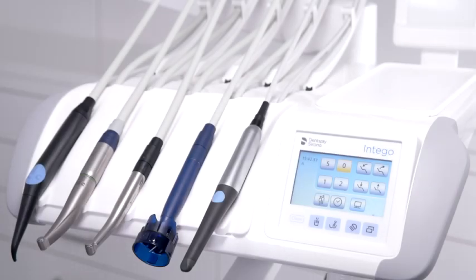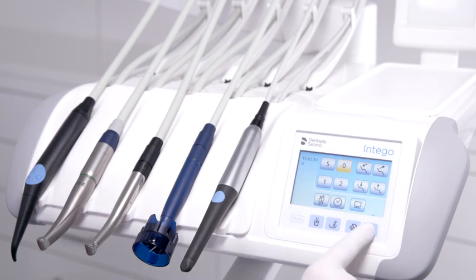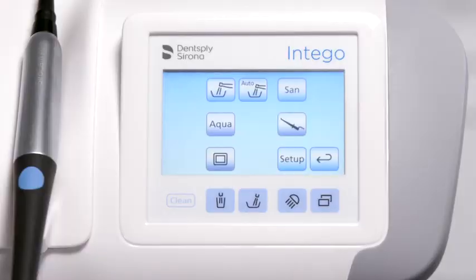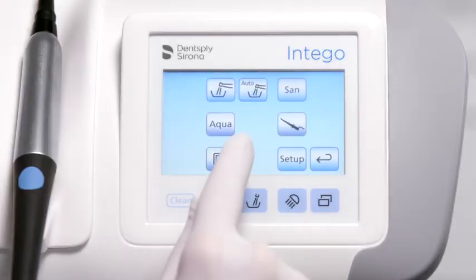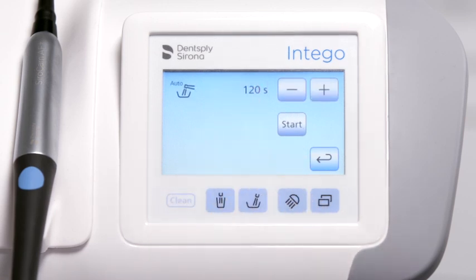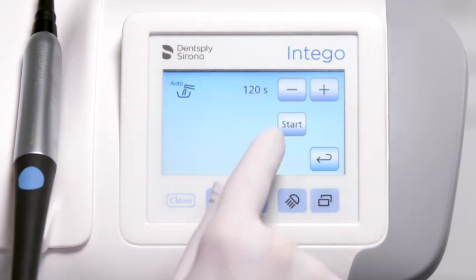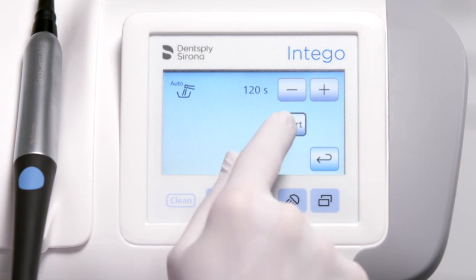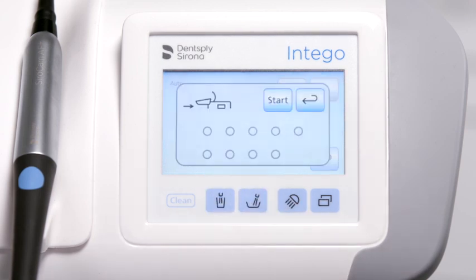If available, use the auto purge function to flush the water lines in the morning and evening. Press the submenu button in the start screen to open the hygiene programs. Activate the function by pressing the auto purge button to flush the instruments for the set time. Follow the instructions visualized on the screen.